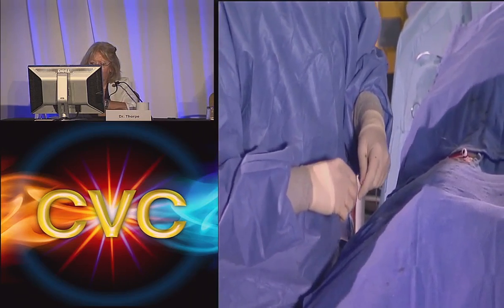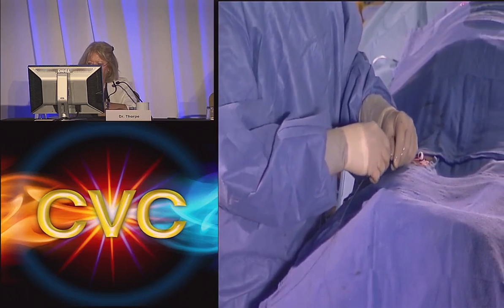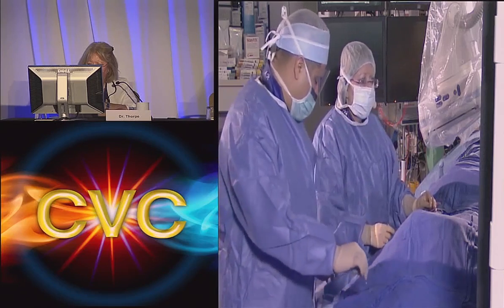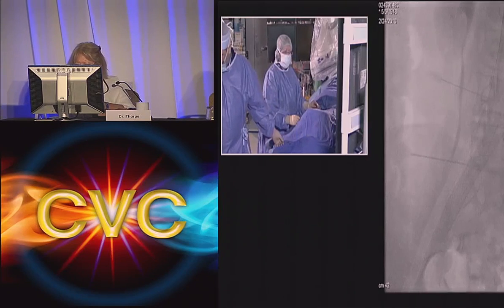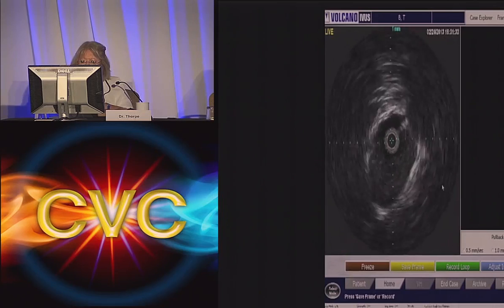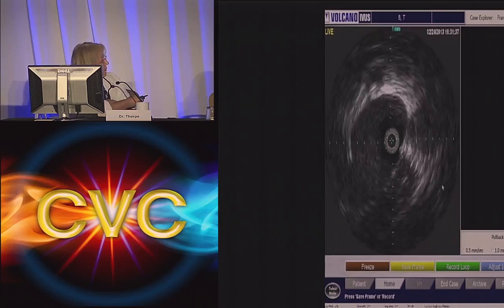We'll go up here with this monorail, 6 French. Now, left over from her episode 30 years ago are some synechiae in the external iliac vein segment. Do you want to ring down, please? There you go. So we see those. This is the normal femoral vein in her thigh coming up.